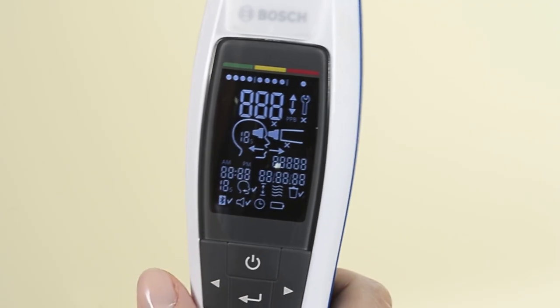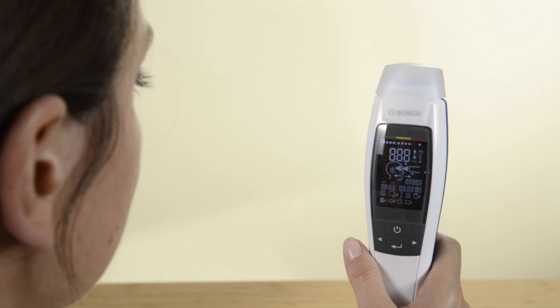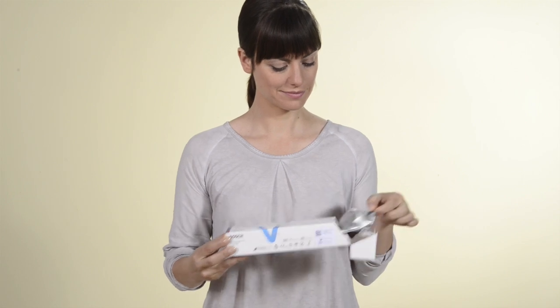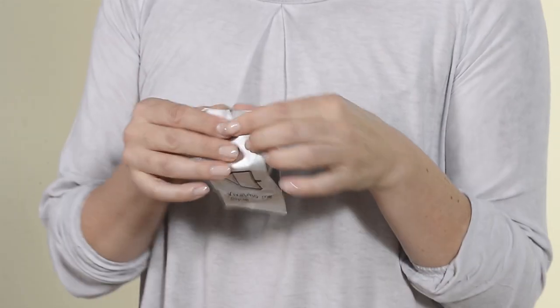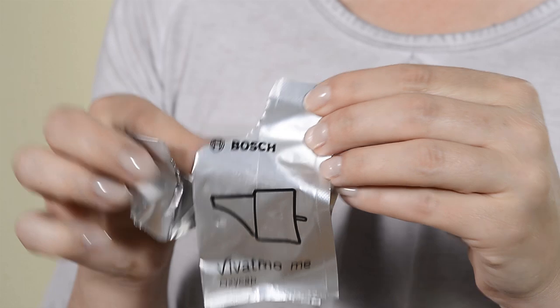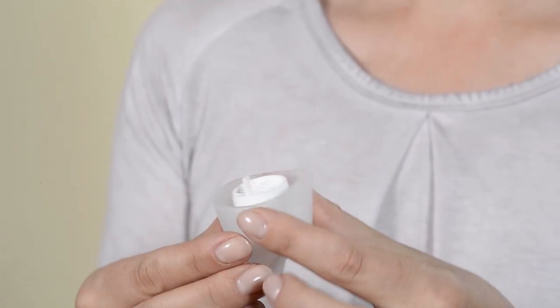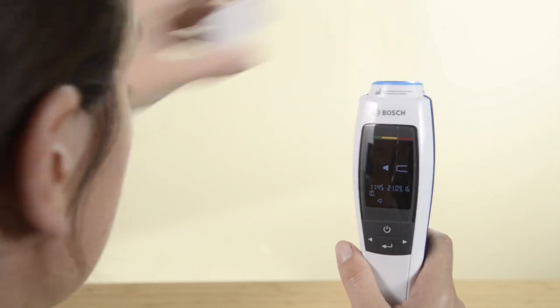After a brief start-up phase, a prompt appears on the display instructing you to fit the disposable mouthpiece. Remove this from the pouch. Make sure that you use it within 15 minutes, because the complex active substances of the Oxycaps must not be exposed for too long. Now take off the protective cap and fit the mouthpiece onto the device the right way around.